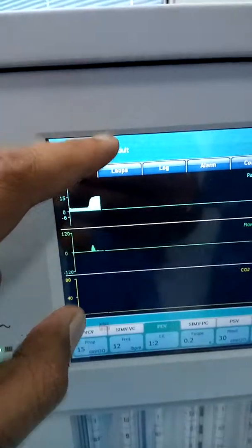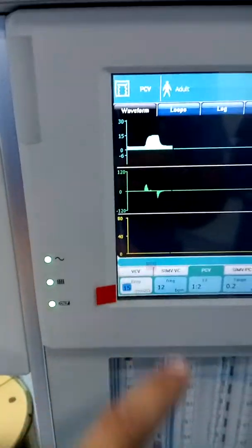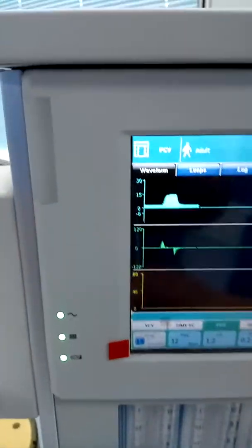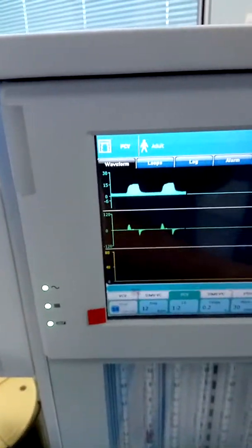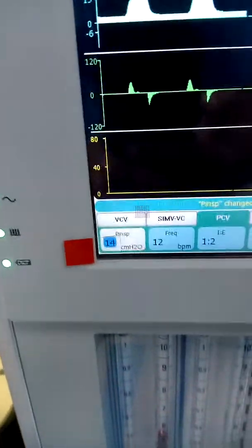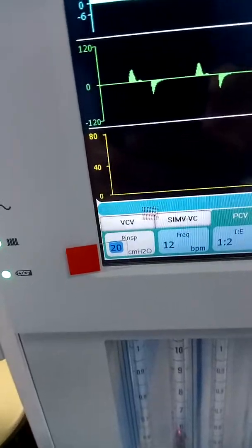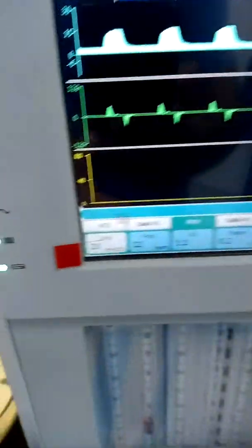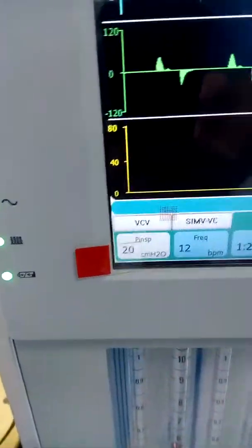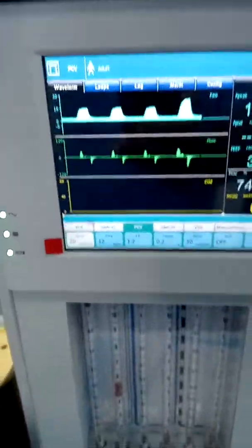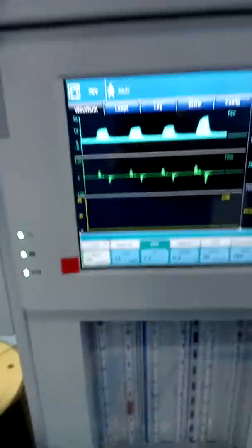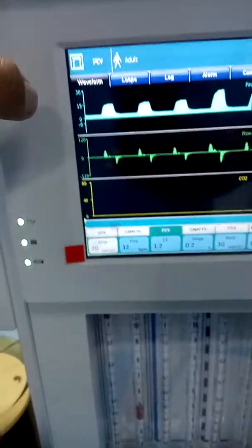Now you can set the inspiratory pressure. This is the knob — you touch it and you can set the pressure to 20 cmH2O, then press the knob to confirm.